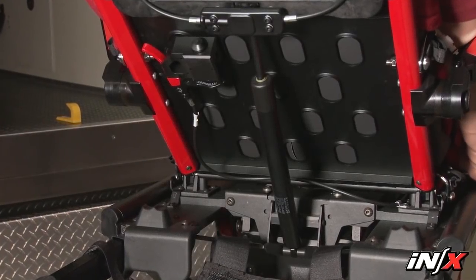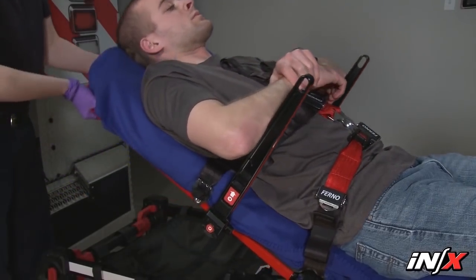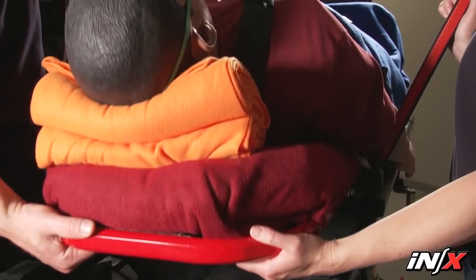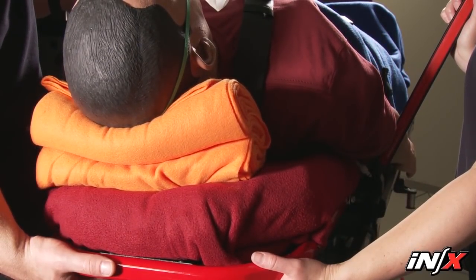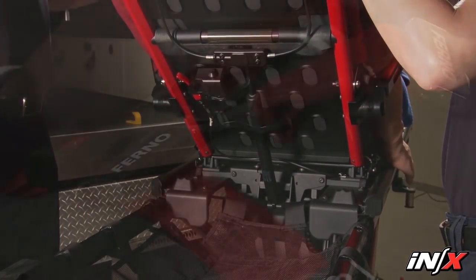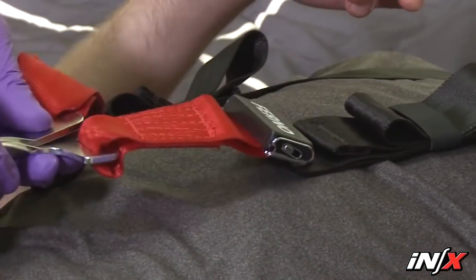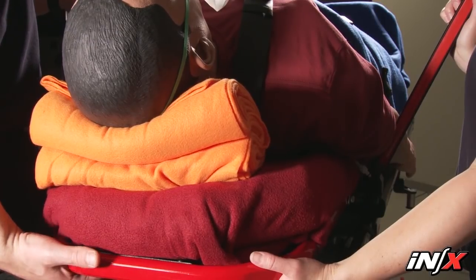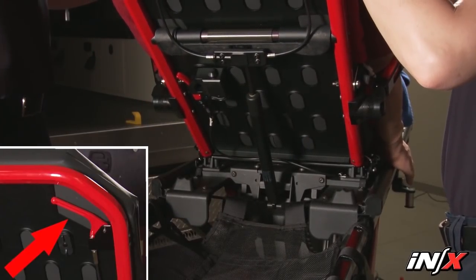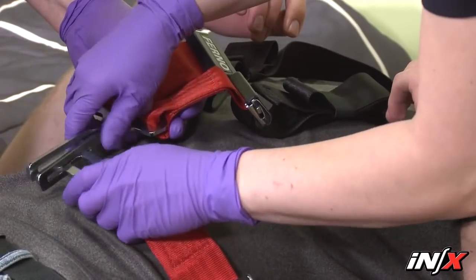The backrest is equipped with a pressurized cylinder to assist raising and lowering it from zero to 76 degrees to achieve maximum patient comfort or medical necessity. With a heavy patient, support the patient's weight before adjusting the backrest. With a light patient, control the upward movement so it doesn't move too quickly. To adjust the backrest, loosen or unbuckle the pelvis and/or chest straps if needed. Support the weight of the backrest and patient, and squeeze either red control handle toward the frame, then raise or lower the backrest to the desired position. Lastly, fasten and adjust the patient restraints as needed.